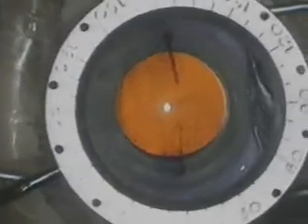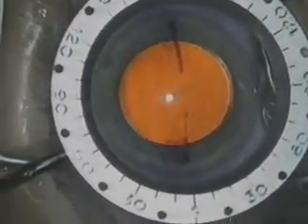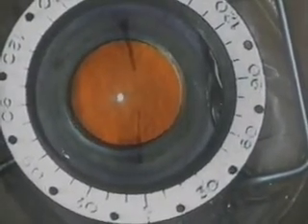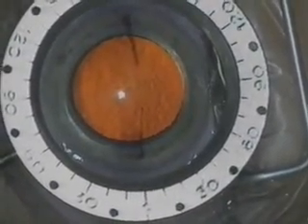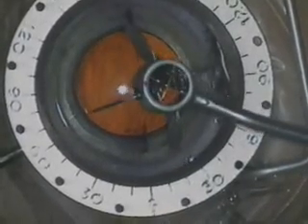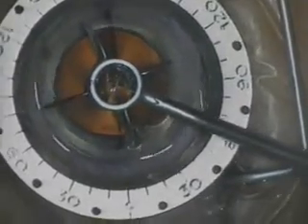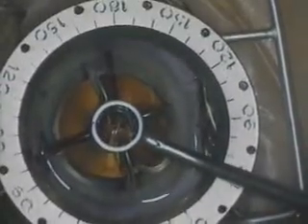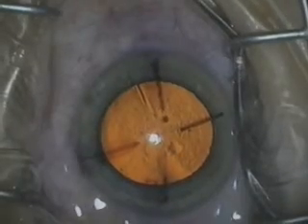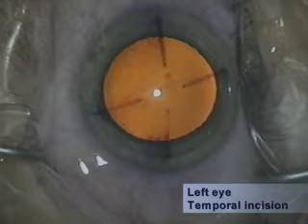The first procedure in the implantation of the microcyl toric of human optics is the precise marking of the steepest corneal axis. For that purpose, a calibration ring is adjusted to the horizontal or 0-degree axis reference points previously marked on the eye. Using the 0-degree axis as reference point, the steepest corneal axis is then marked using a corneal marker. In this example, the steepest axis is 110 degrees.